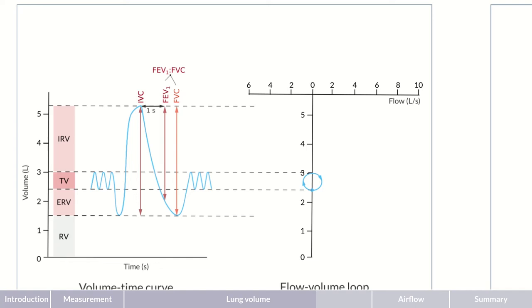Now let's look at the rest of the breathing maneuver. The patient is requested to exhale as much as they can, followed by taking a deep breath and then forcibly expiring as fast as possible. After this maximal expiration, only the residual volume remains in the lungs. The patient is requested to maximally inspire, increasing the lung volume until the vital capacity is reached. The curve now takes the form of a bulge. At the beginning of inspiration, airflow increases and then later decreases as the lungs fill up with air again.